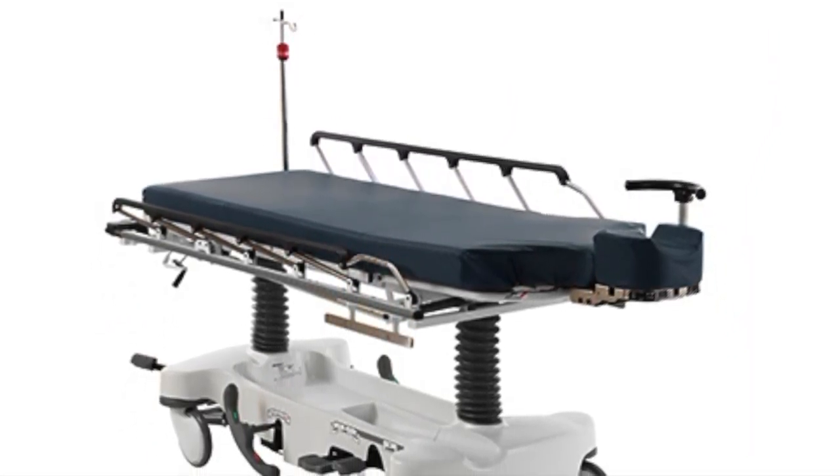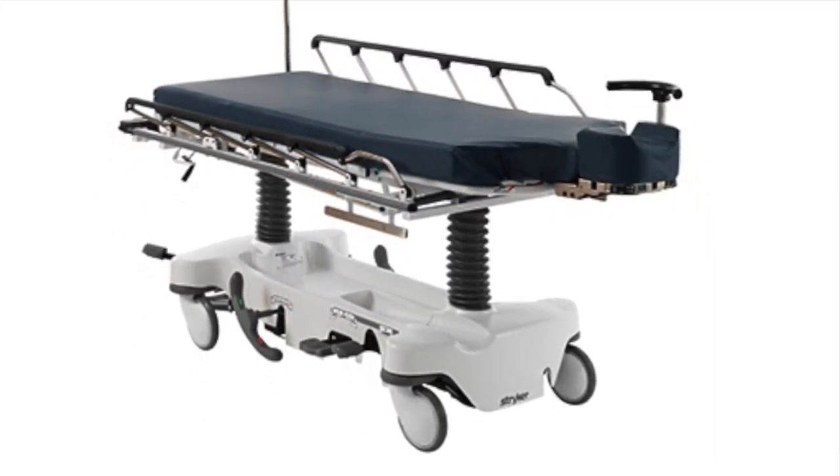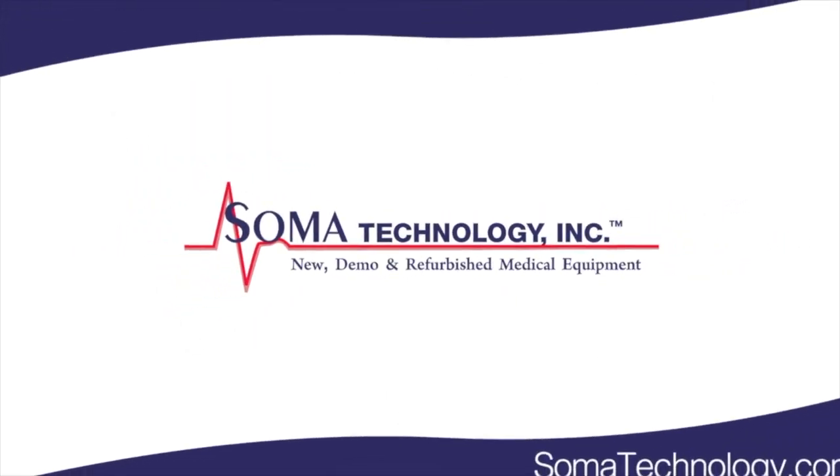To view more information about the Stryker 1079 Eye Surgery Stretcher or other products, please visit somatechnology.com.